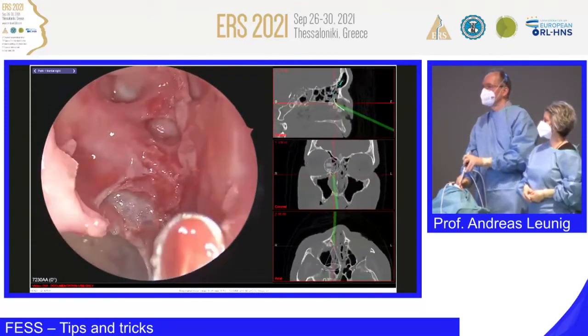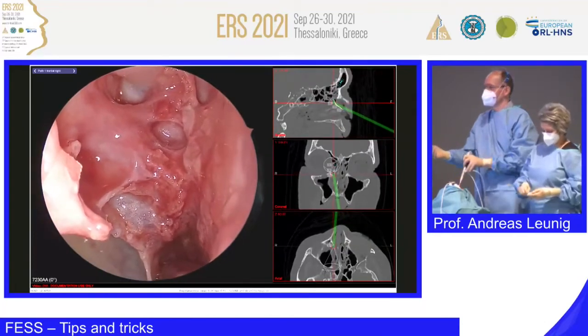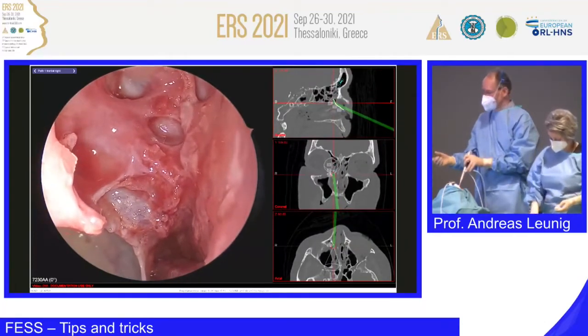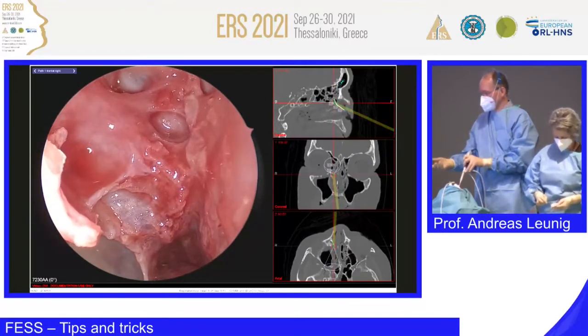What I do, I use navigation. Mrs. Hartmann, it's your turn. It's just to demonstrate to you. Please straighten it. Yeah, to take this one.